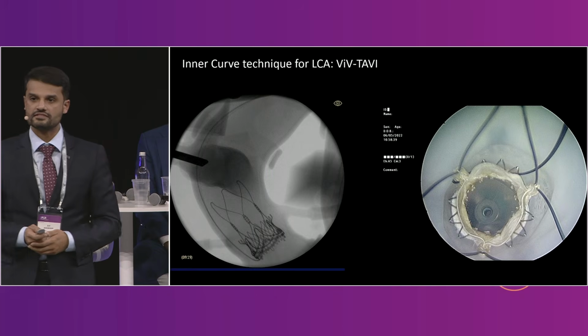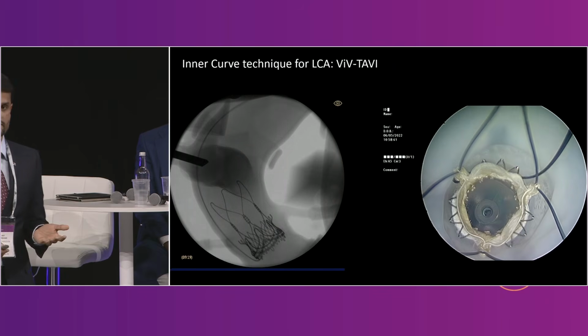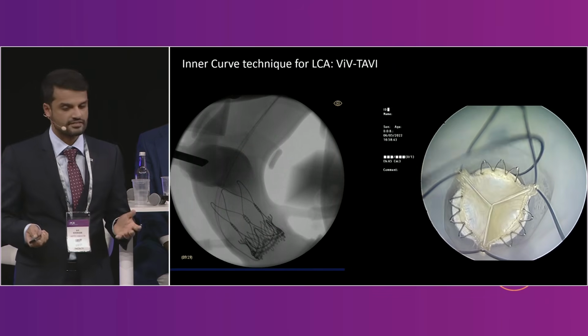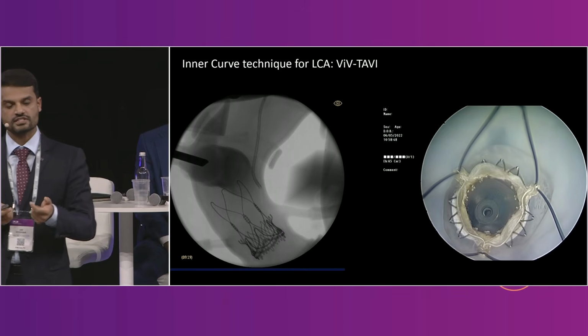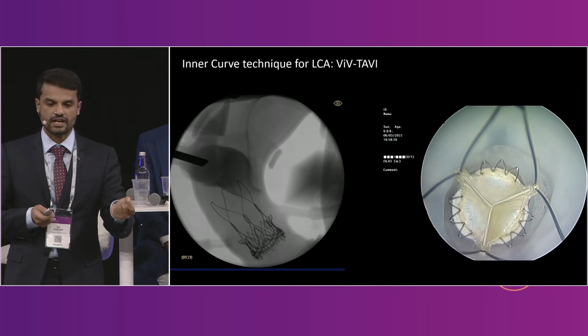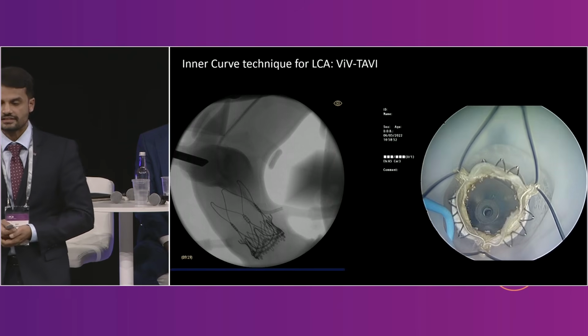Here we've got a valve-in-valve TAVI setting. Once again, same concept. We've got an oversized Judkins left 6 catheter. The catheter comes down, pull the wire back, closes the Judkins shape, and you can drop down and enter into the sinus. Arif, can you go a bit deeper in that?